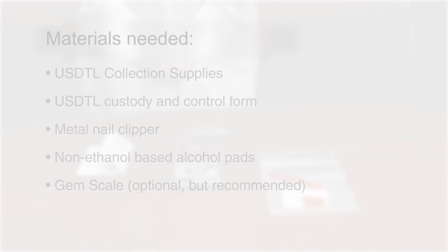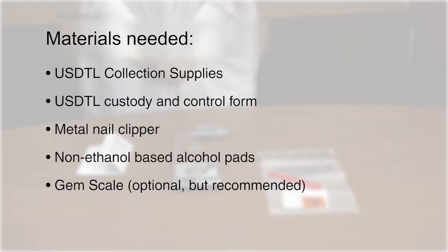Welcome to USDTL's fingernail collection instructions video. Materials needed: USDTL collection supplies, USDTL custody and control form, metal nail clipper, non-ethanol based alcohol pads, and a gem scale.